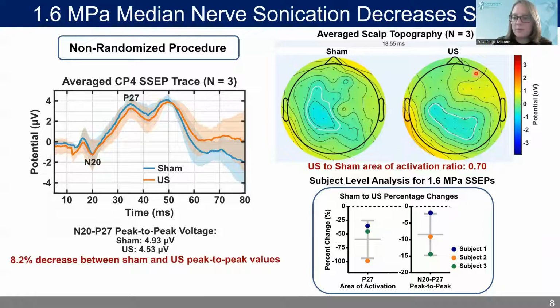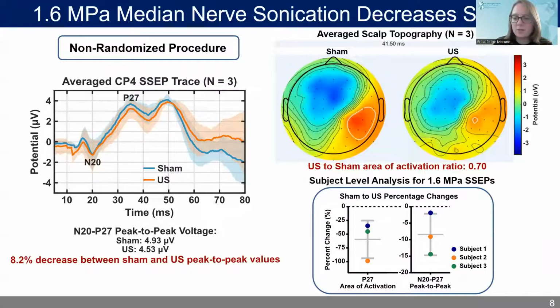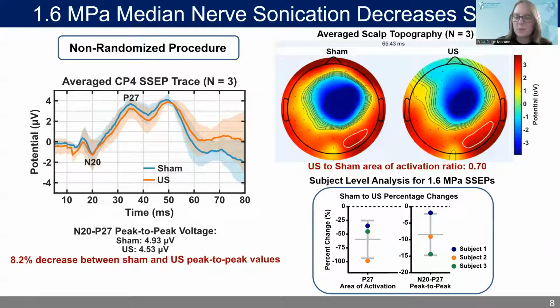Next, we can take a look at a video of the scalp topography from the P15 to N60 deflections. The white line on each scalp map tracks the size of the area of activation at each time point. This area of activation is quantified as the region that contains signal within a -3 dB range of the maximum potential in the somatosensory region between the two conditions. Across time, there is a consistent activation reduction in the FUS condition compared to the sham condition, with a 0.7 ratio between the two.